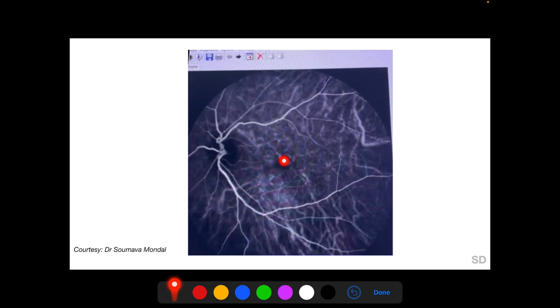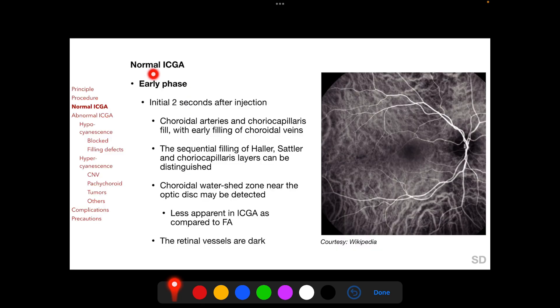Normal ICGA is divided into an early phase, a mid phase, and a late phase. The early phase starts two seconds after injection when the choroidal arteries and choriocapillaries fill sequentially, with early filling of the choroidal veins. A choroidal watershed zone may be identified passing near the optic disc, between the supply territories of the lateral and medial posterior ciliary arteries. In the initial seconds, retinal vessels appear dark. Both in FA and ICGA, the choroidal circulation starts to fill earlier than the retinal circulation.